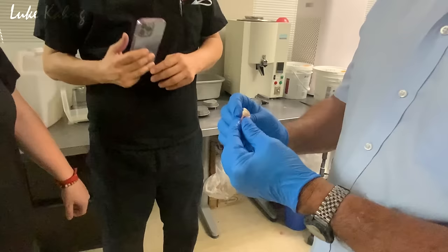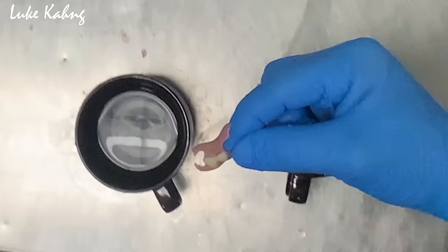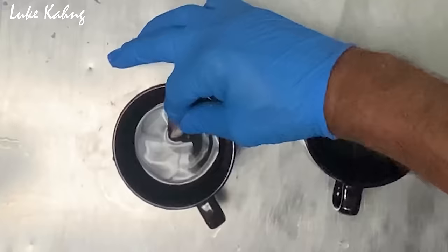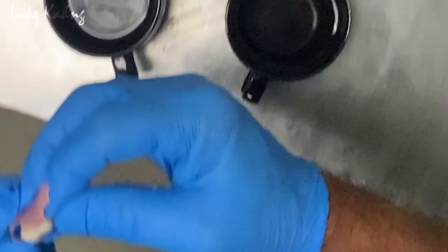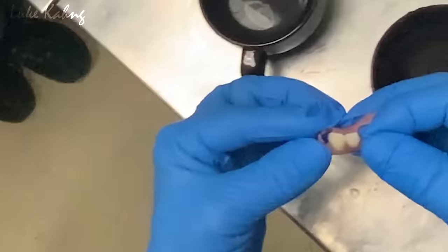Okay. We'll go right here. Oh, you got the cold water? Okay. So this is how we can tighten up. You place it in very hot water. You place it in there for about 30 seconds, all depending on how hot the water is. You put it in there. Okay. So you remove it. You bend the clasp in like this, and you run it under cold water.